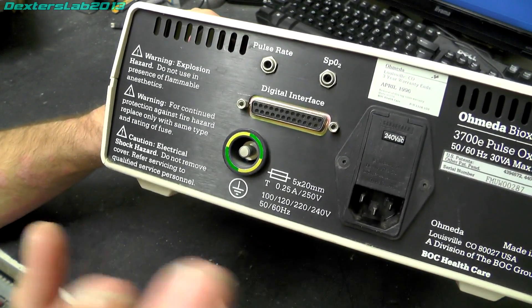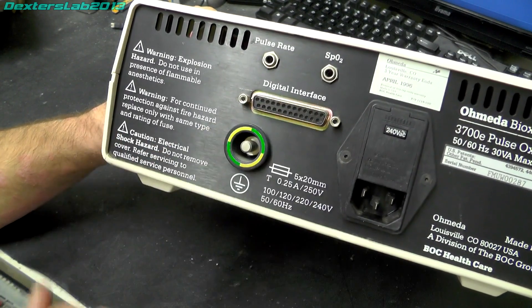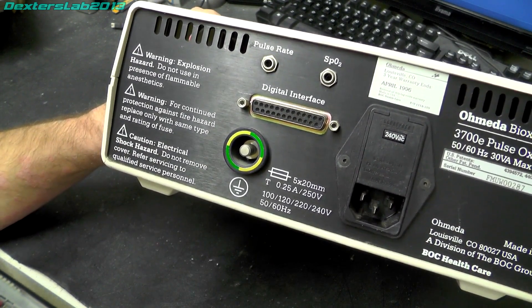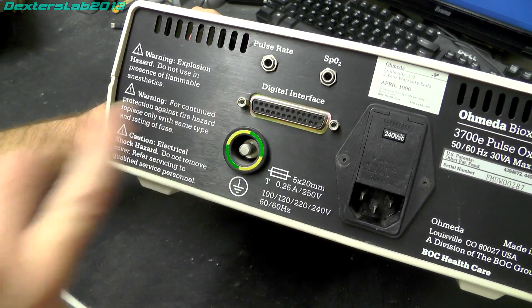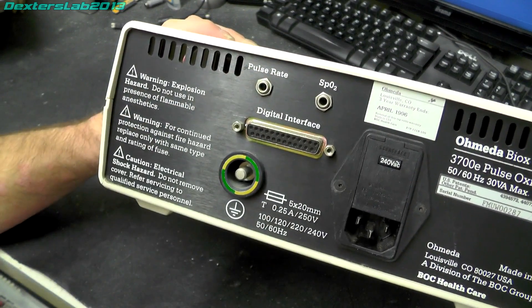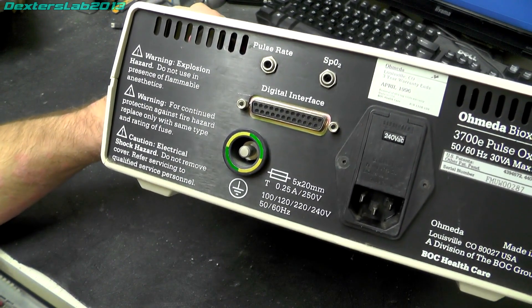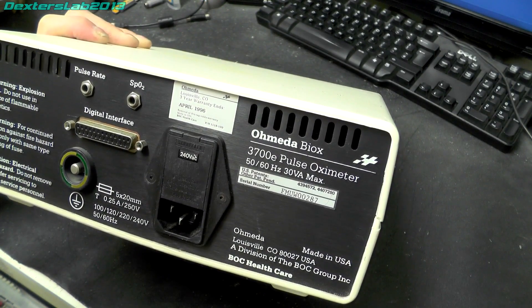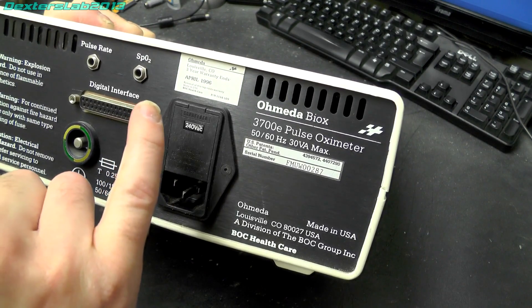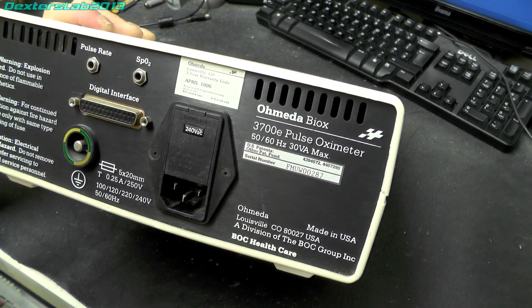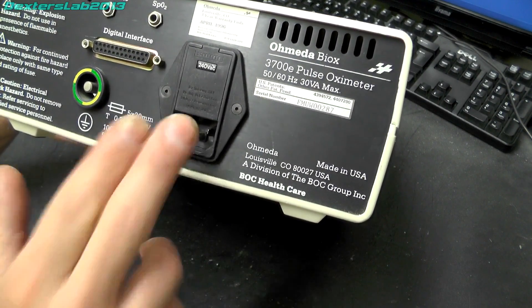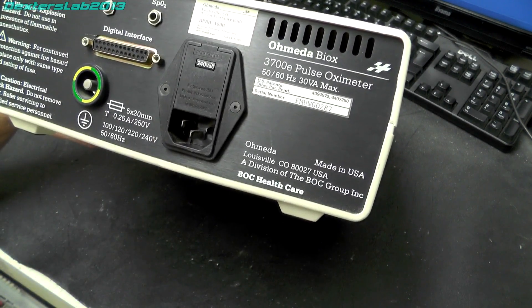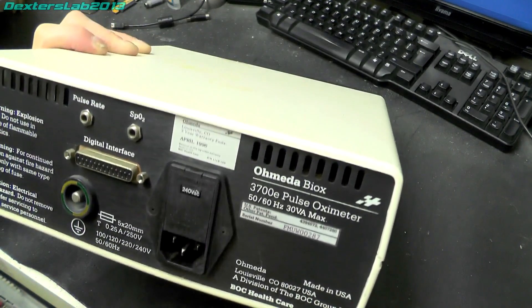On the back we've got a large earthing point, digital interface which I believe is RS-232. We've got a pulse rate output and an SpO2 output as well and I believe those are connecting up to a chart recorder. So a little other details are we've got three year warranty ends April 1996, I think that is somewhat expired now. Mains input with voltage switchable input there and that's pretty much it.